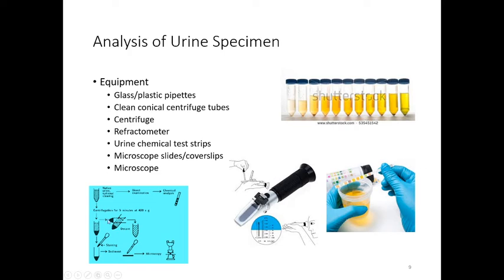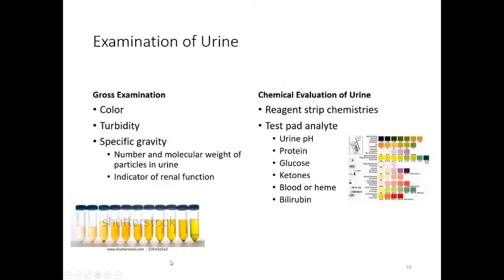So we've got our urine specific gravity, and so we're measuring the concentration. We've done our chemical stick. The rest of it we're going to centrifuge down, and if you look at the bottom of some of these, you can see there's sediment at the bottom. So these are urine that has been centrifuged. We are going to pour that extra urine out, and what's left in that bottom will stay there. So we pour it out. It can be kind of scary to do because you've just collected it, but you pour that out. We don't want that. We put a couple drops of urine sediment stain in there, mix it up, put a drop on a slide, and look at it under the microscope. So super easy test to do, and we're going to be looking at some cells underneath.